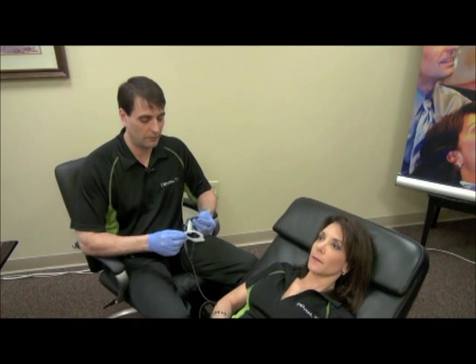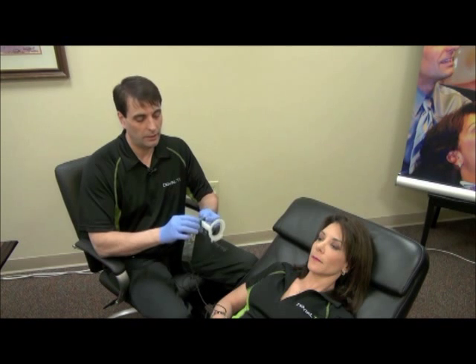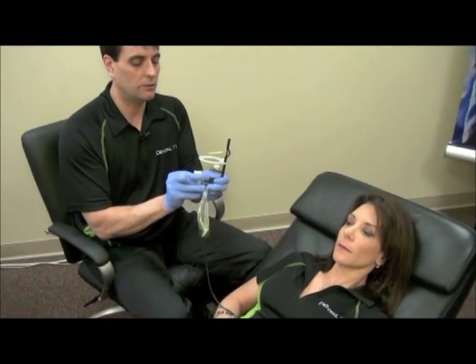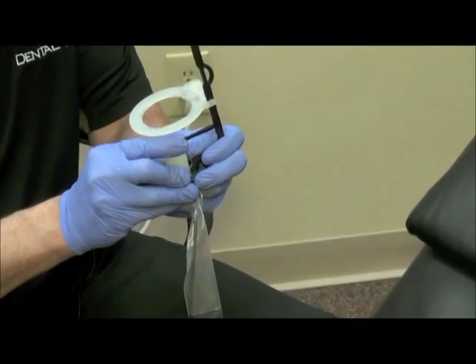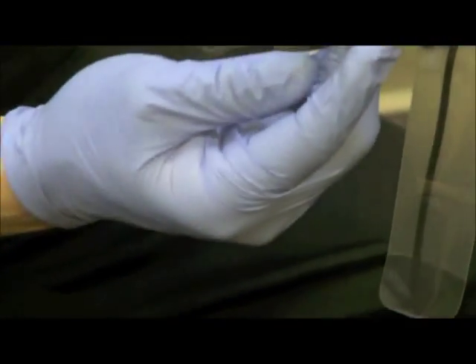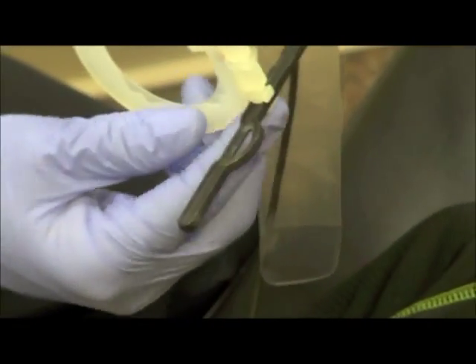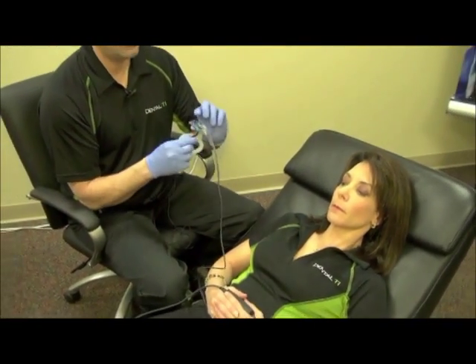The next holder we'll be covering is the anterior Chimera holder — it's color coded blue. It's got a little white bite block that slides onto the holder that the patient can bite on, which helps stabilize for anterior shots and takes up the additional space. It also has the alignment ring. I normally push the ring back closer to where it flares out so we can clear the nose on an anterior PA.